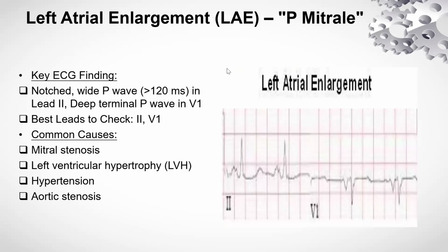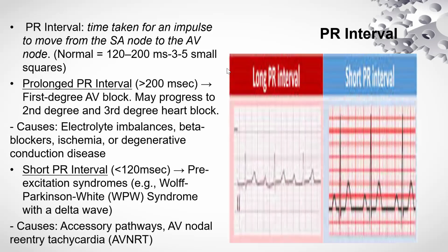Okay, so this is here, P mitrale. Mitral stenosis: you'll see the notched wide P waves. So the intervals, like I said, you raise your ECG, you look at the rate, then we look at the intervals, and let's look at the intervals, okay?